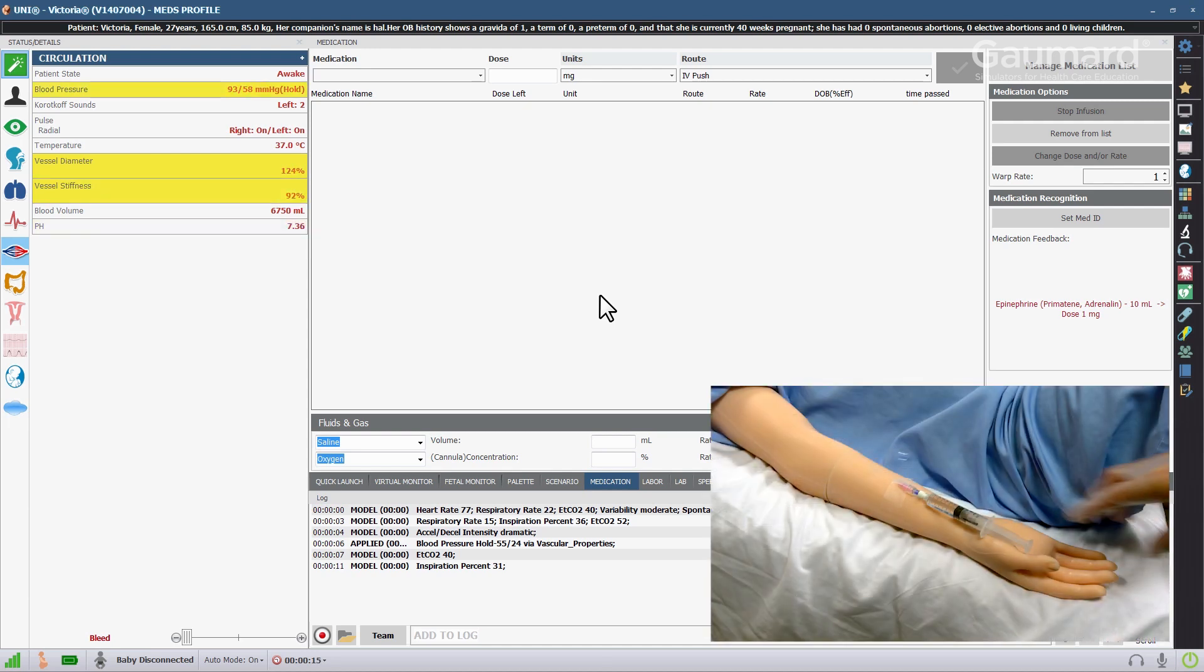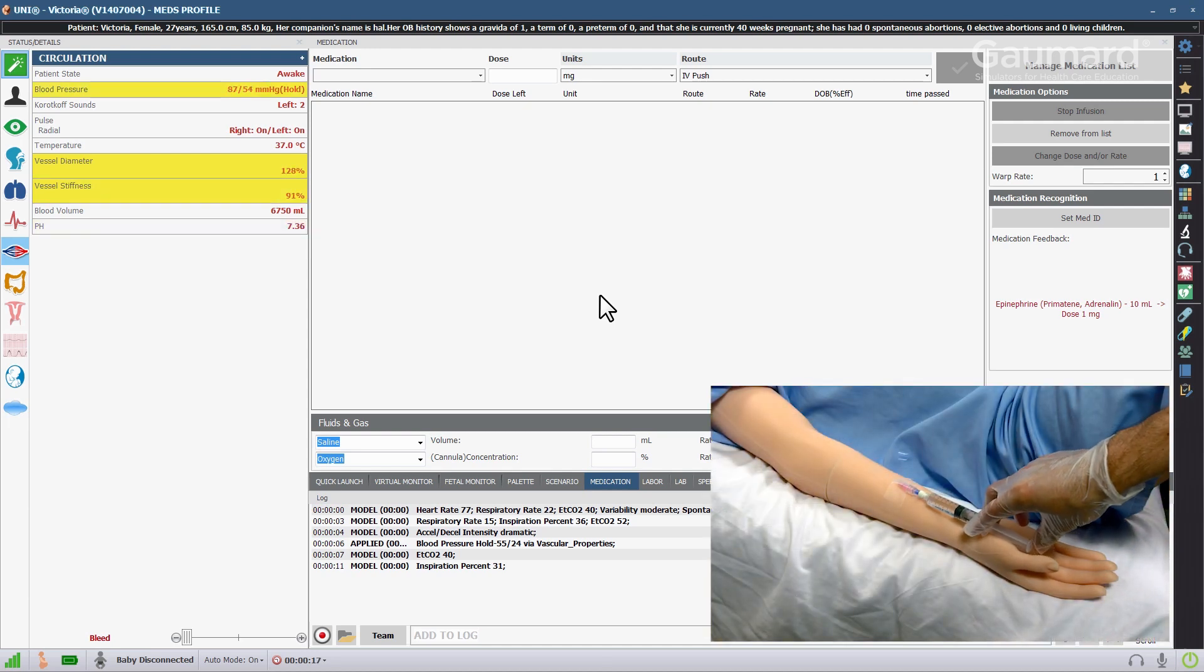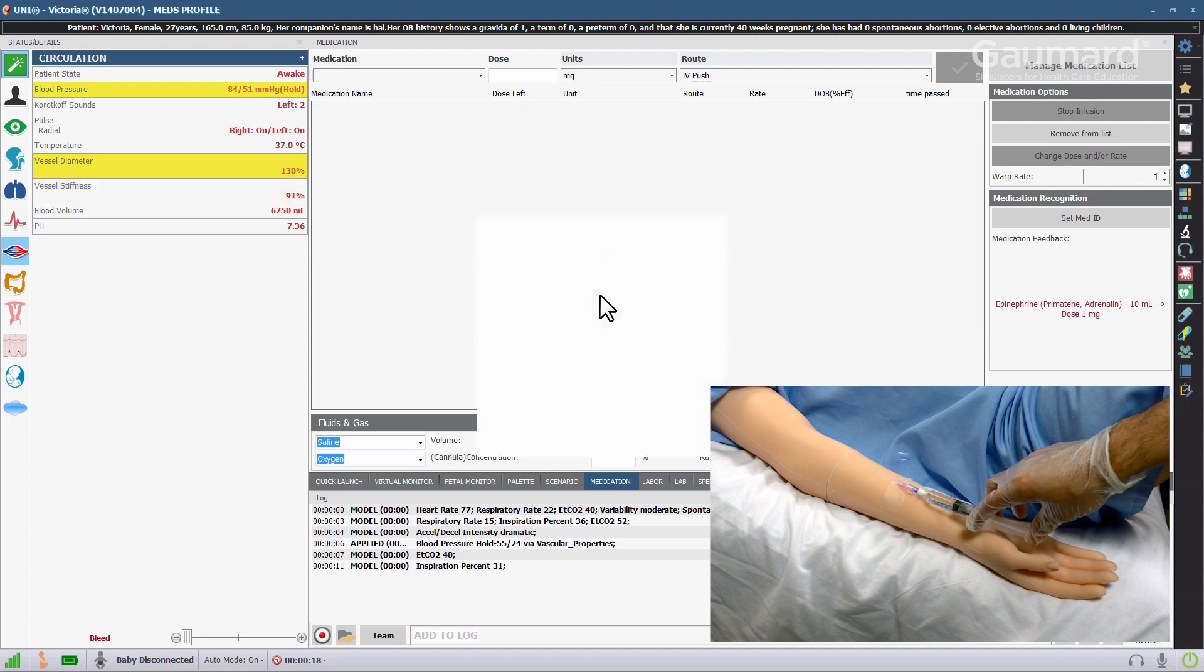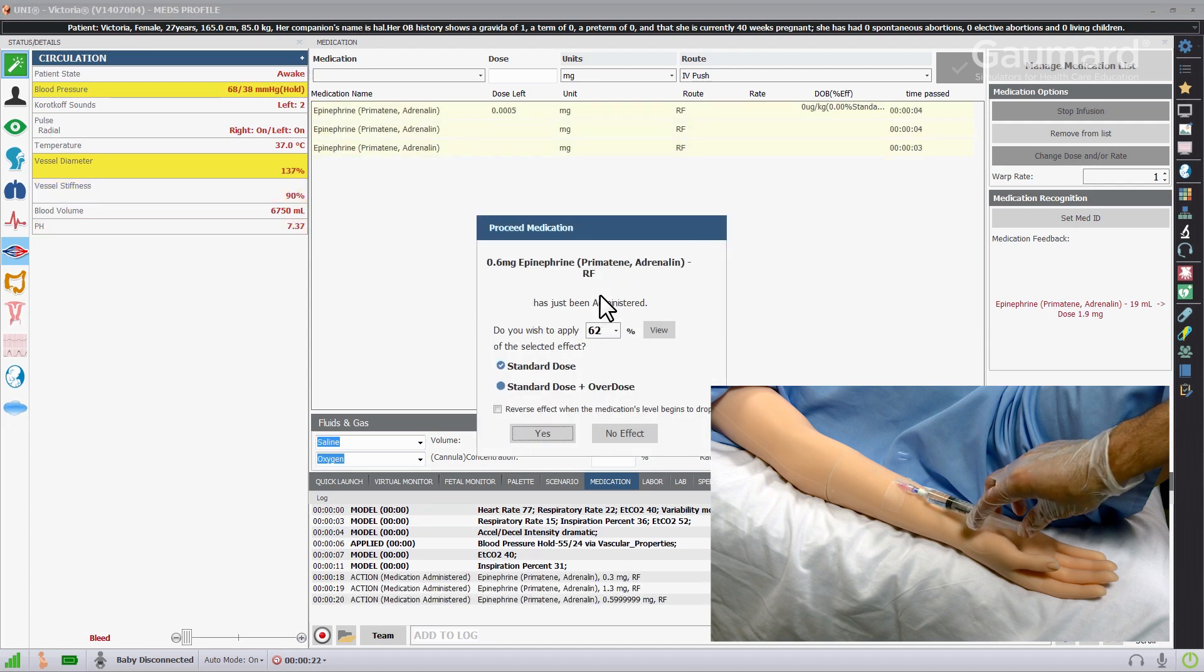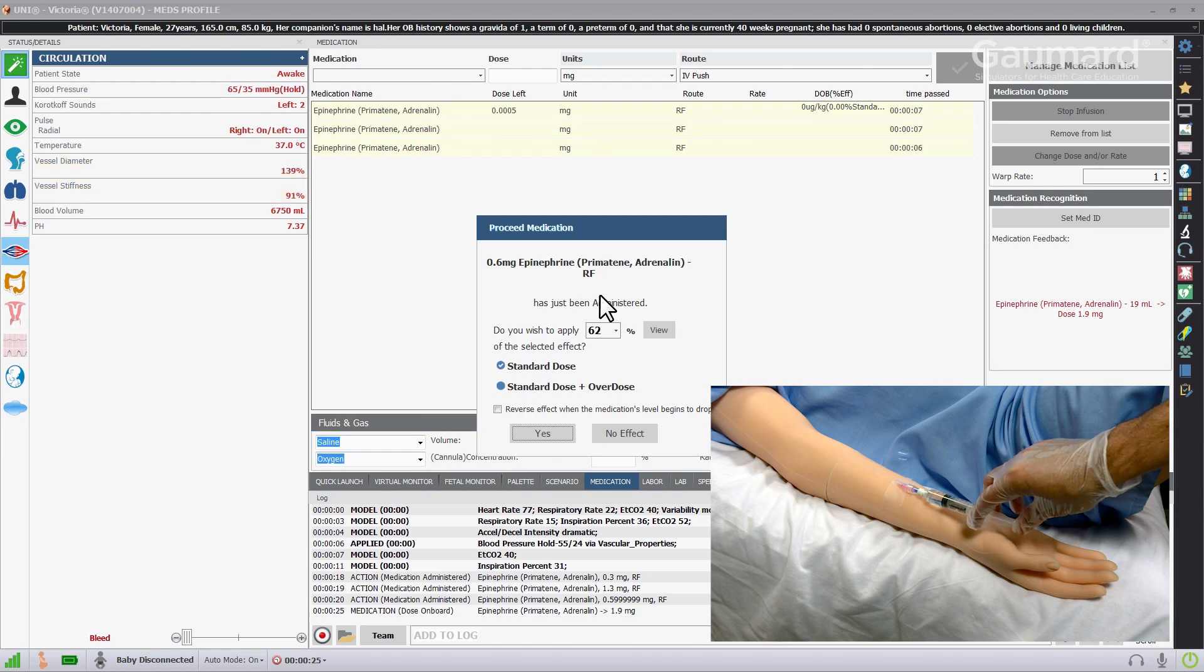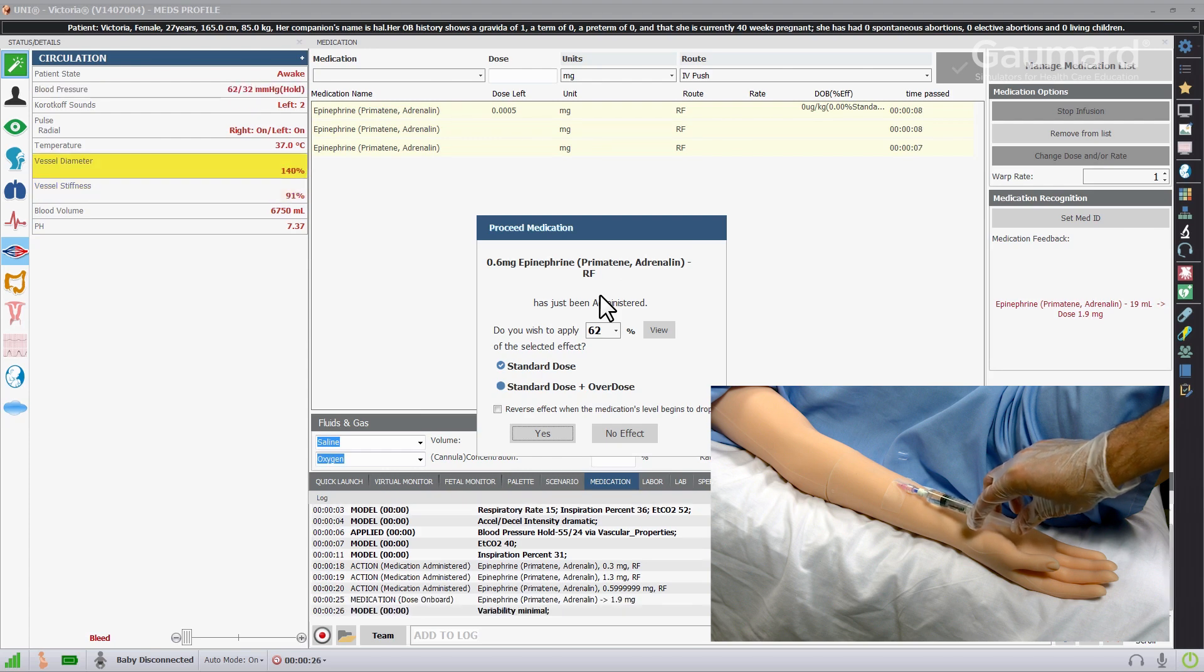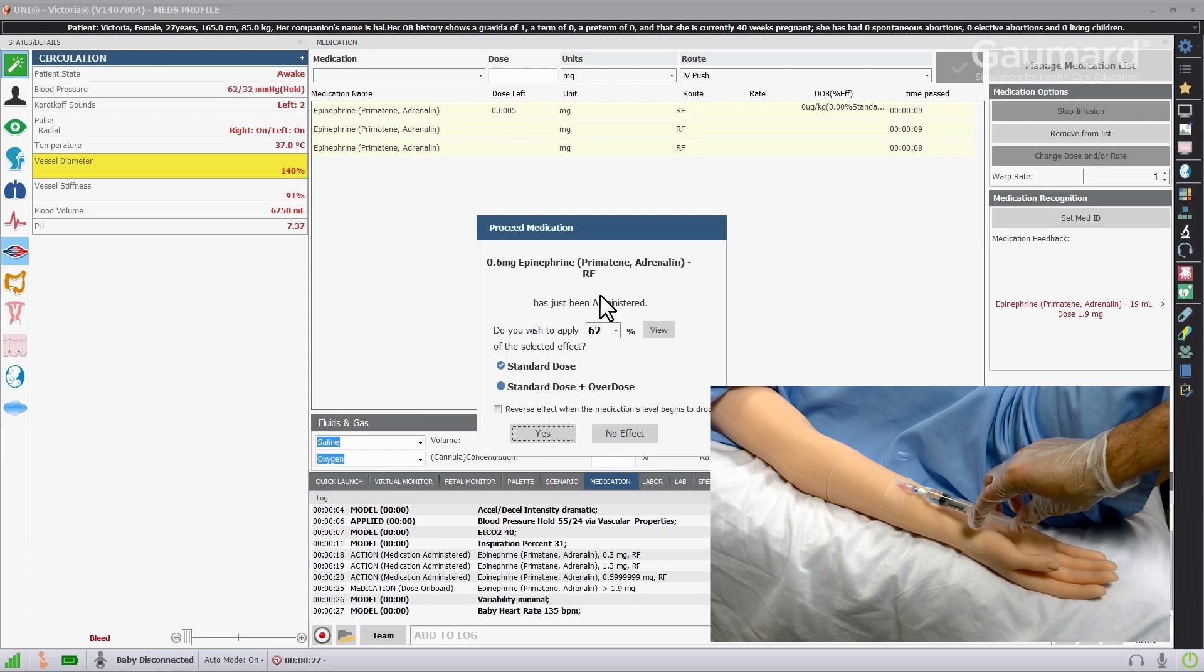Inject water into the right arm vasculature while keeping the syringe within 10 inches of the wrist. The software will detect the syringe and document the appropriate amount of fluid and the correct drug identity. In the automatic operating mode, it will apply the correct response based on the dose and the effects of the medication.